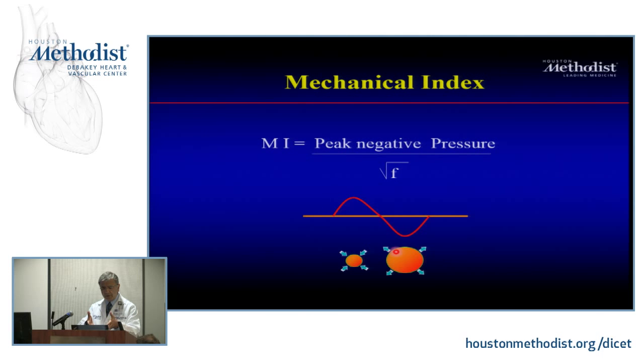So why is this important? Because if you use it for bubbles or other things, it is not the positive pressure, it's the negative pressure, right? So you have a wave that goes positive, negative. And if you're driving close to somebody who has a big boom box, you feel the positive pressure much more than the negative pressure. So just imagine on the negative pressure what happens to these. This is where the burst of ultrasound bubbles occurs. Now, we're talking theoretical here because it is a fraction of a millisecond that this occurs. You can't really differentiate positive from negative, right? I mean, this is a very short duration. Okay? So we'll keep that in mind.